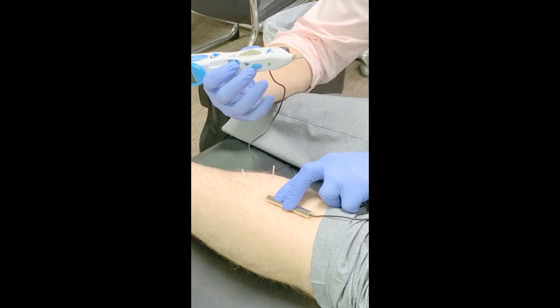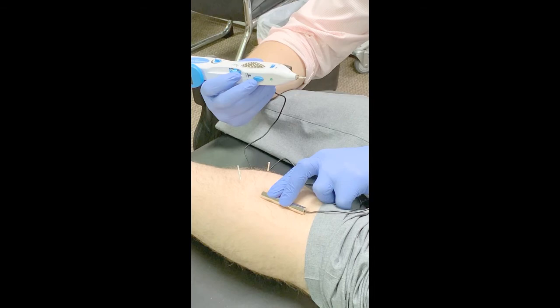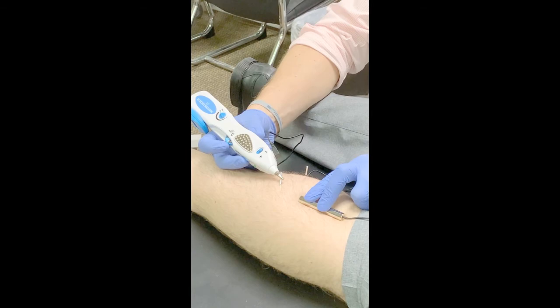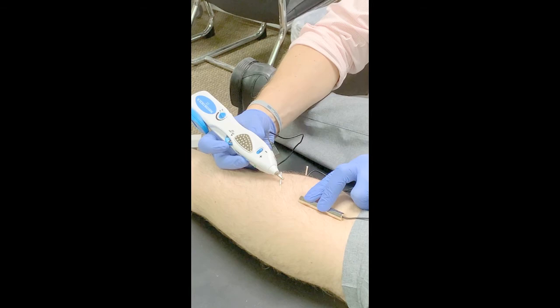We obviously can't conduct through clothing and that sort of thing. So I'll just ground the bar superiorly, metal-to-metal contact, and now a single-needle stim using the Pointer Excel. That's helpful not only for proper use, but also to troubleshoot if your unit isn't working properly.